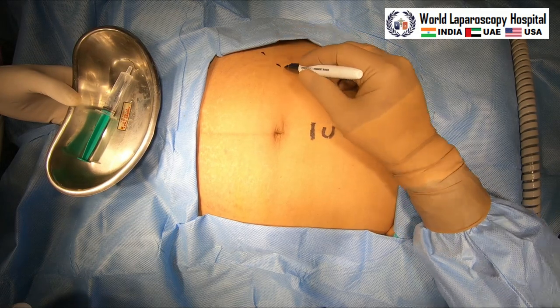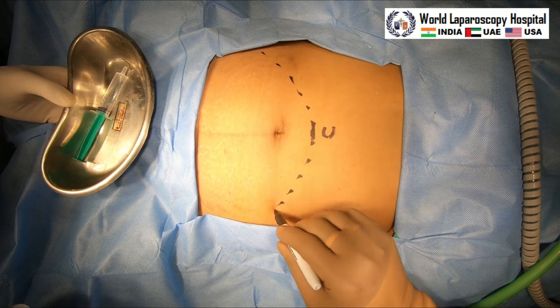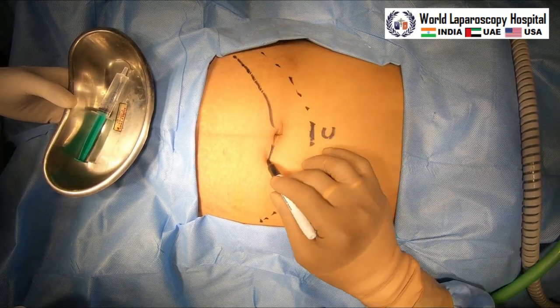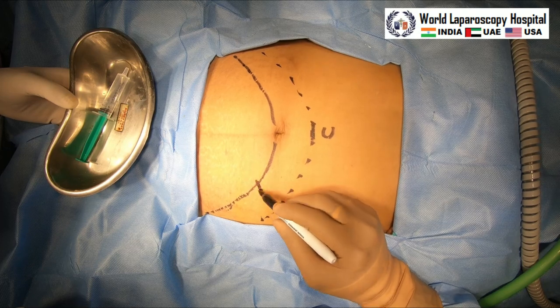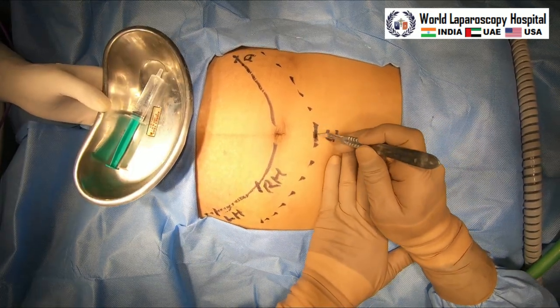Generally this arc is 24 cm. And the telescope will be at 18 cm. This is 7.5 cm lateral to the umbilicus. So here will be one port and another there. Three ports only we will use for this surgery.